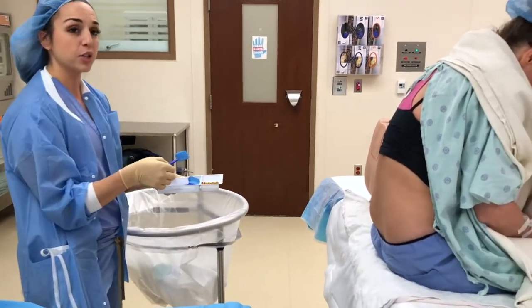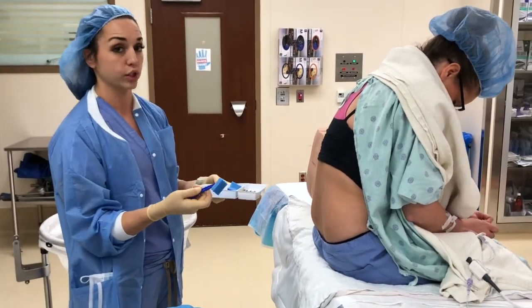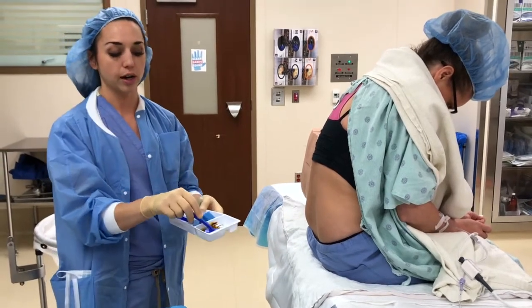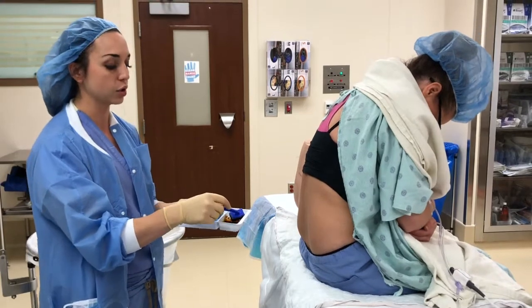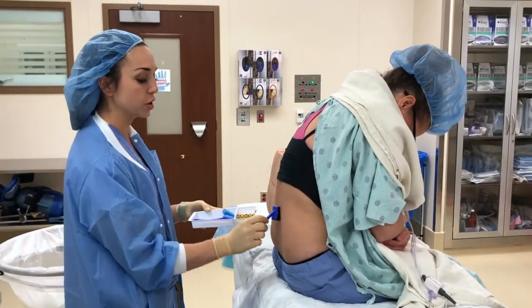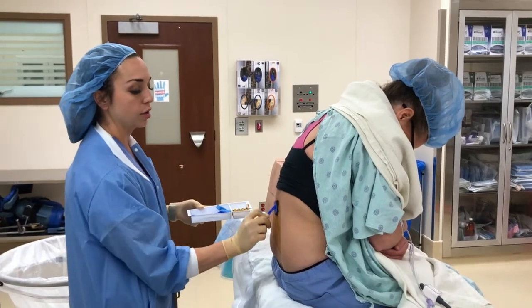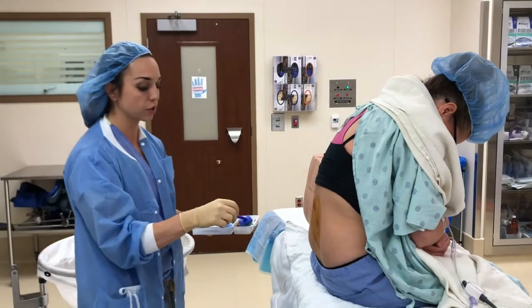At this time I usually say, okay mom, I'm going to clean your back. You're going to feel some cold, scratchy solution on your back. You're going to take your sponge and dip it in your povidone-iodine solution. So, okay, a little bit of cold, scratchy solution here. And remember to go in a circular motion from inside out. Toss it into the trash when you're done.